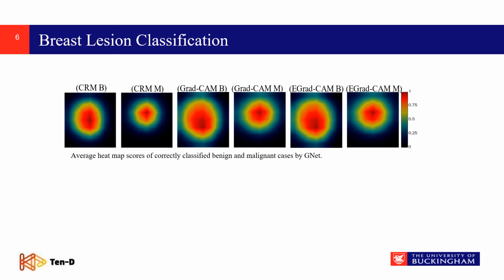In all these three visualization techniques, we can see the distribution of the highest important area that contributed to the final decision of the network is completely different, and it shows us that our network uses different region parts to classify benign and malignant ones.